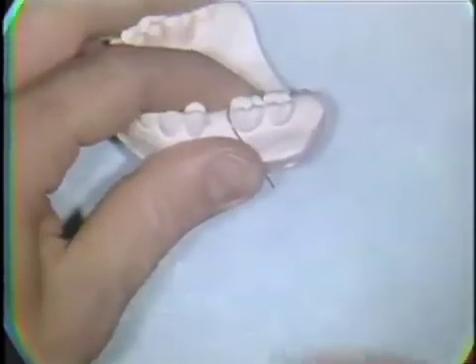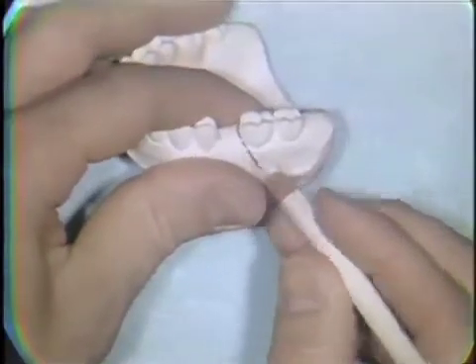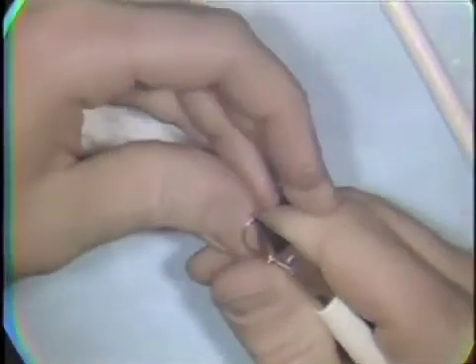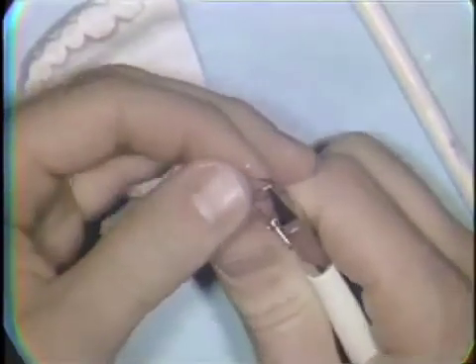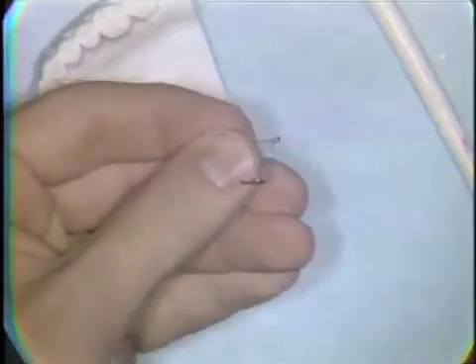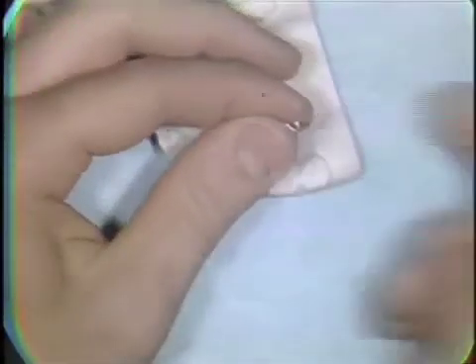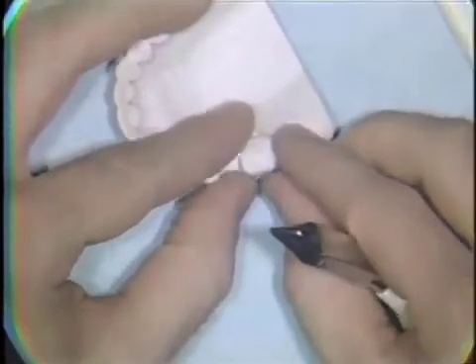You have to try the wire on the model a number of times in order to adapt it properly. On the buccal aspect, a small loop is bent into the wire to protect the cheek tissues. The loop is bent so that it's parallel to the buccal surface of the molar tooth. The excess wire is removed, the loop is closed completely, and you try the fingerspring back on the model.